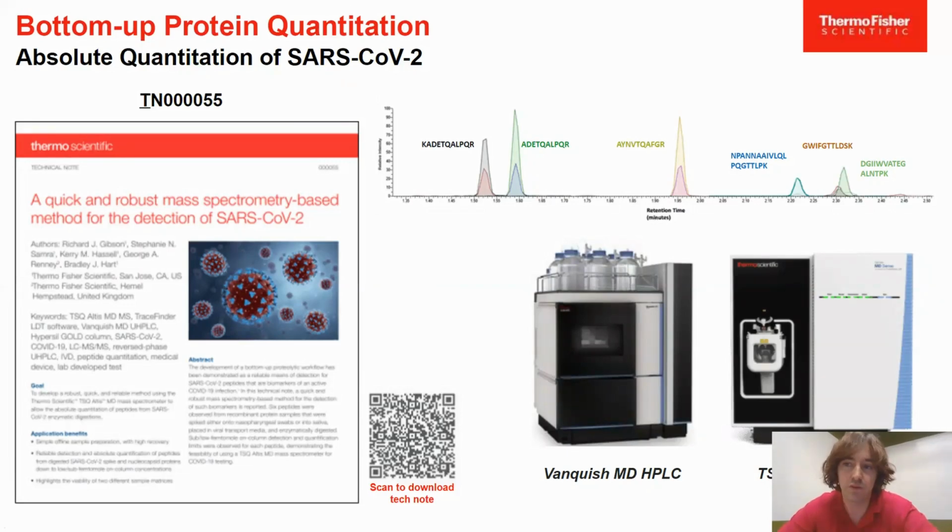So our next step was to include stable isotope-labelled standards captured by anti-peptide antibodies, which is also known as SISCAPA. This is a peptide enrichment method that is placed after the digestion step and allows the separation of target peptides from almost anything else in the sample, creating ultra-pure samples. This technique utilizes rabbit antibodies that have strong affinity towards epitopes in the target peptides. They're commercially available from a third party and are pre-coated onto magnetic beads. This allows easy separation from the sample after peptide binding with a magnet.